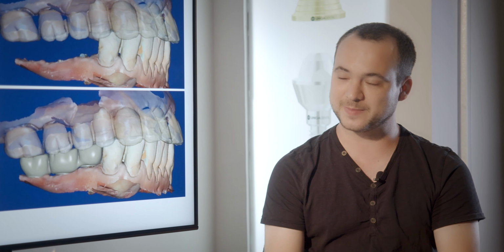I need to tell it to the doctor. The doctor needs to call the patient again. He needs to take the impressions again, and then he sends me the impressions again. I make a stone model, and I start all the work from the start.